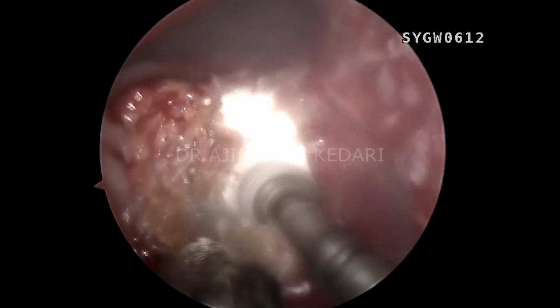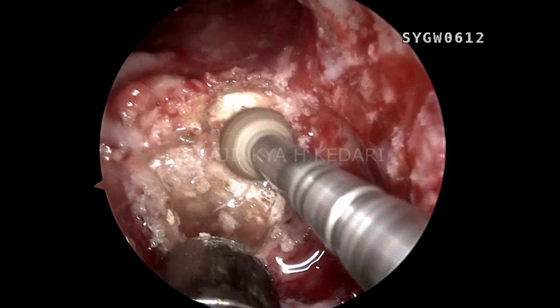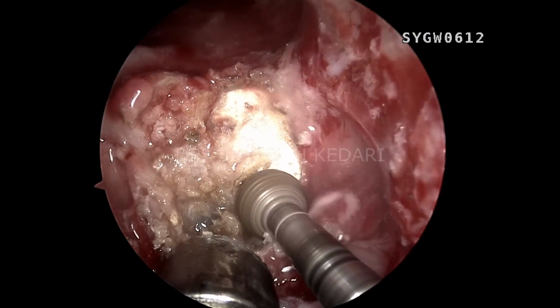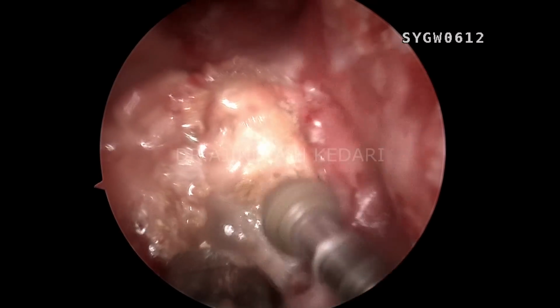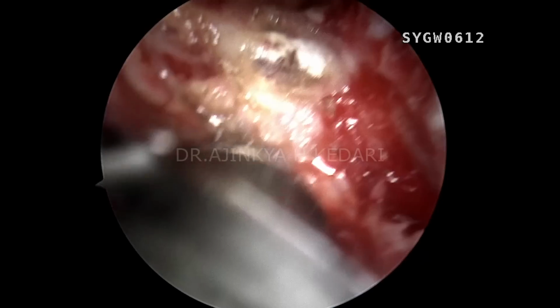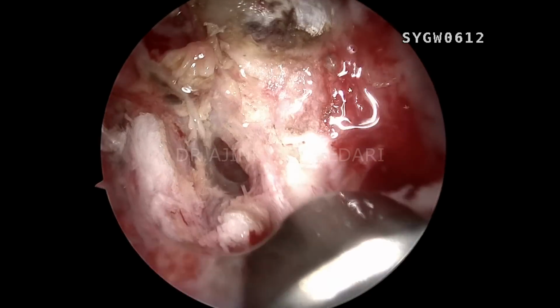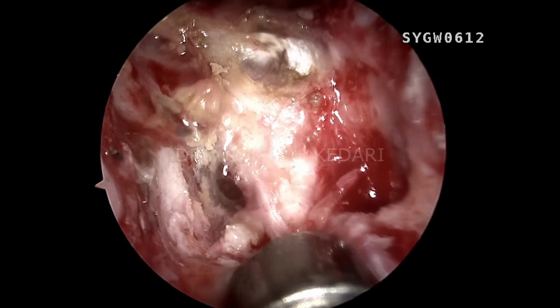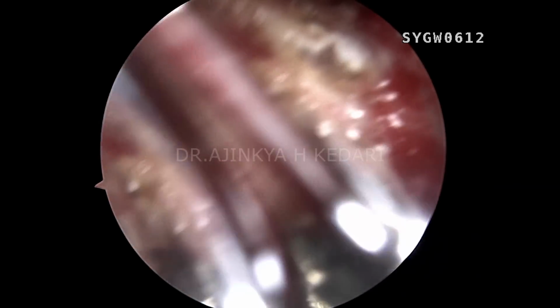So what I'm going to do is take away all that fibrotic thick bone, expose the defect head on, and assess the area of the bony defect altogether. You can see that's the defect down there, and the CSF is also coming from up there. That's a huge defect that we've uncovered after drilling the bone.